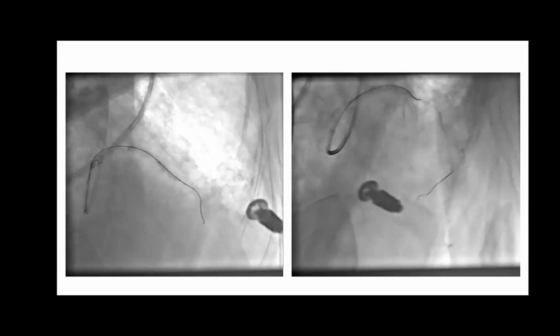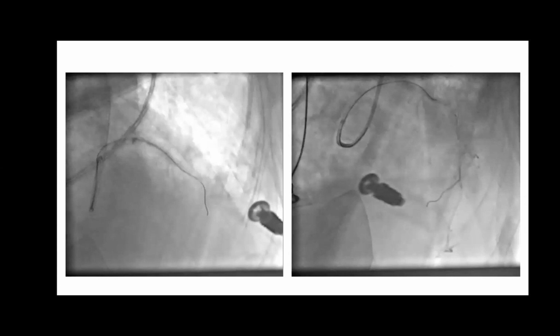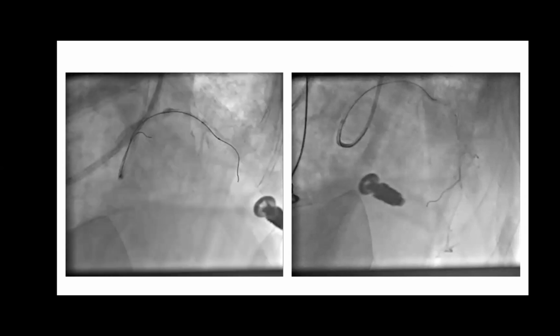The good sign was that we could see the branch, we could see the wire going into the branches. And presumably CPR is still ongoing here, is it? Yeah, the Lucas device is on.